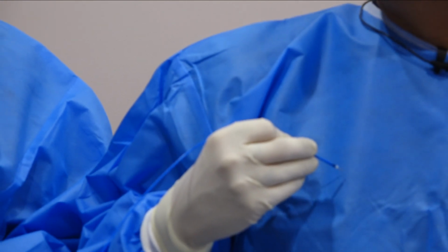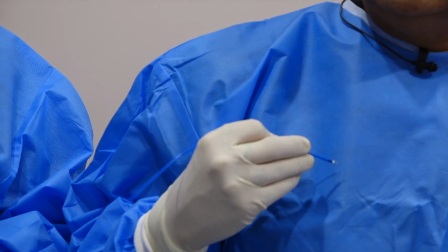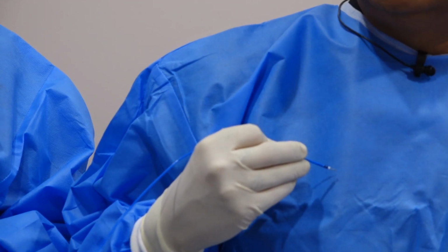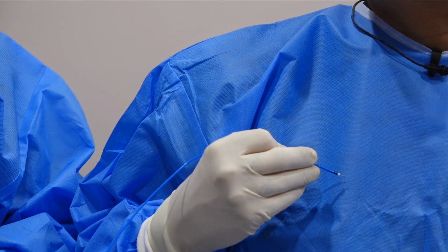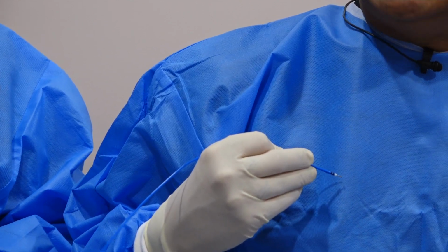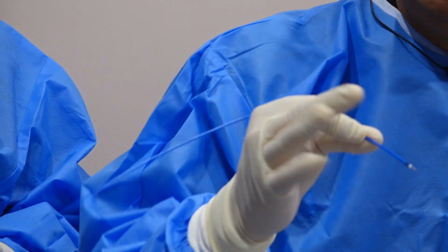I don't know if you can see that or not, but yes, we can see it a little better now. You can see the focus needle. Just go back a little bit. Focus. Yes, that's it. Perfect. Okay. So the knife is almost 5 millimeter long. So just keep in mind how long the knife is.